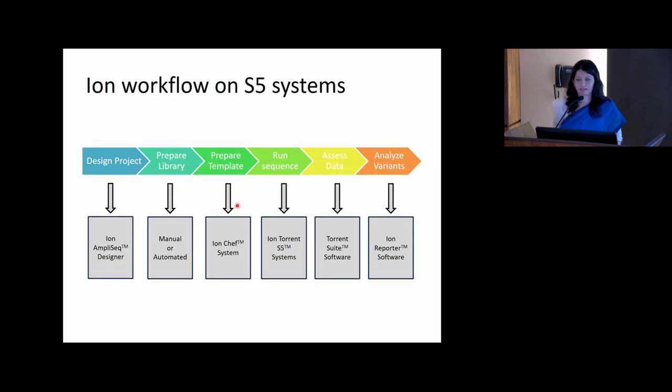So everything starts with what and why: the samples that you'll be looking at. Suppose, for example, we are starting with a myeloid panel. In AMLs, like we saw, there are so many fusions, and even the recent WHO classification has a list of defining abnormalities which is very extensive. So it's always wise to have DNA plus RNA sequencing, whatever best we can do at this stage. According to that, we'll have the panels, or the samples which we are going to proceed with. We'll then go ahead with library preparation.